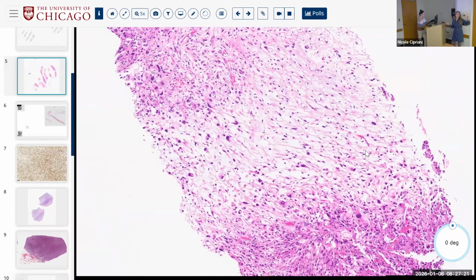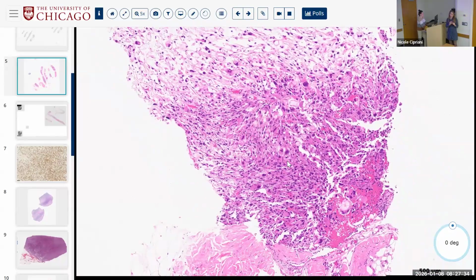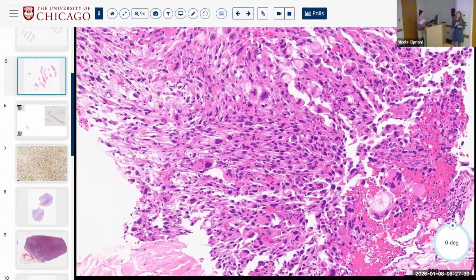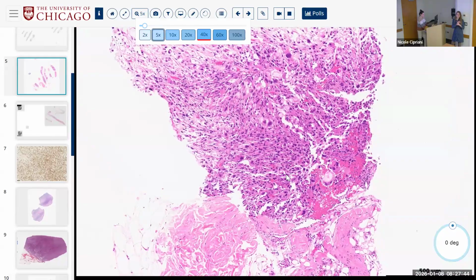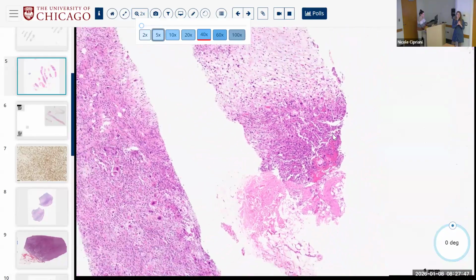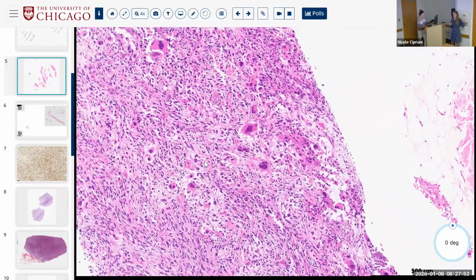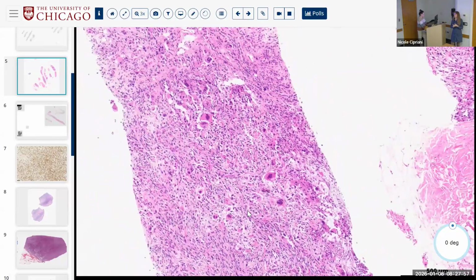What other group of tumors has rhabdoid cytomorphology that you always have to think about in every single organ system with rhabdoid cells? SMARC, right? So the chromatin complex remodeling tumors. INI1 and BRG1 are the proteins that are produced by SMARCA4 and SMARCB1. Whatever, look it up. INI1 and BRG1 are the proteins, those are the immunos. So you'd want to throw an INI1 and BRG1 on here too.